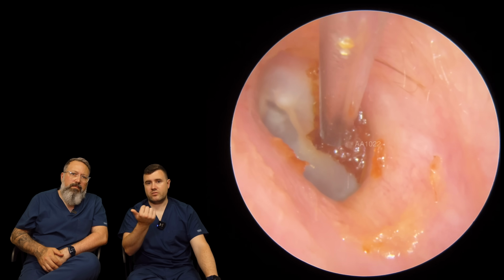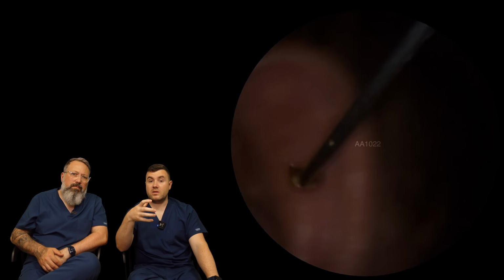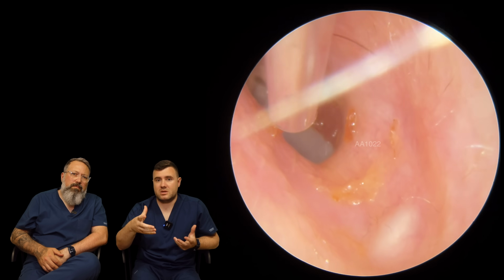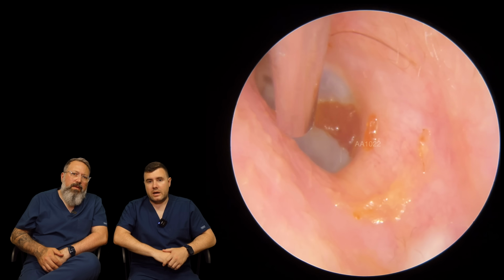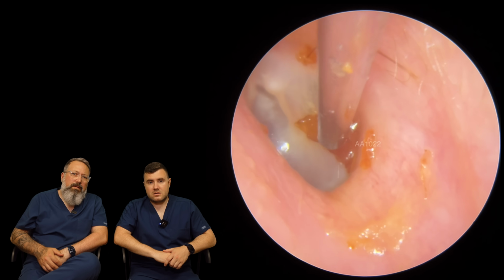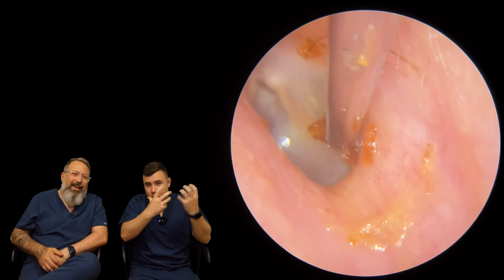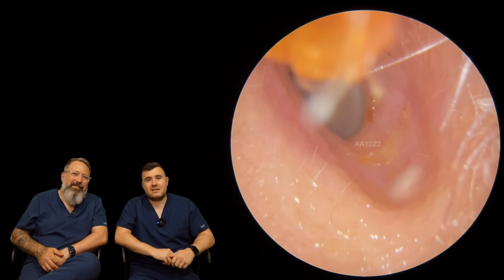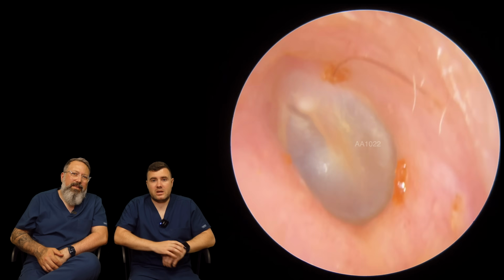Yeah, like we mentioned on Rhys's just now, this one wasn't really given as much issue with the hearing because we could see the eardrum to start with, more of a sensation that something had been pushed in. So yeah, coming away really nicely. Oh, nearly. Yeah, nearly. I'm waiting for this. There it goes. Nice. Yeah, squeaky looking eardrum, nice and squeaky clean.